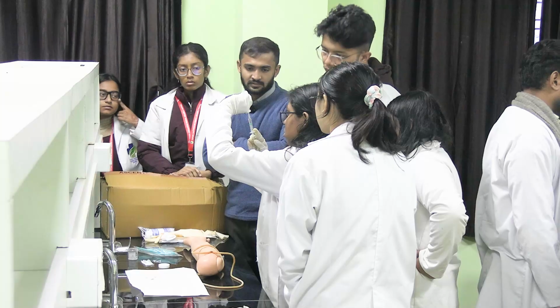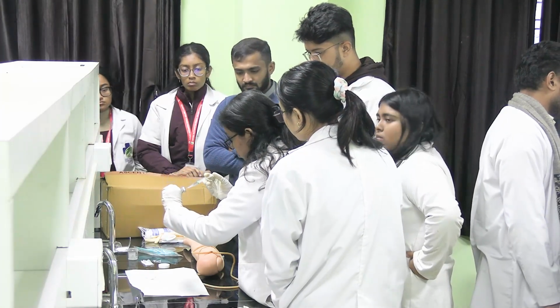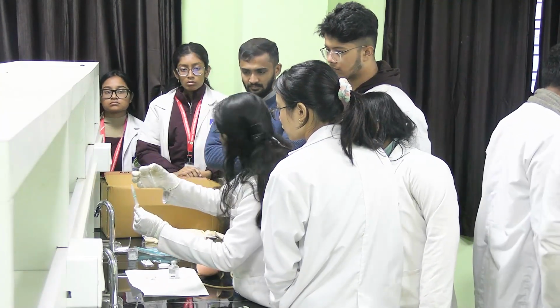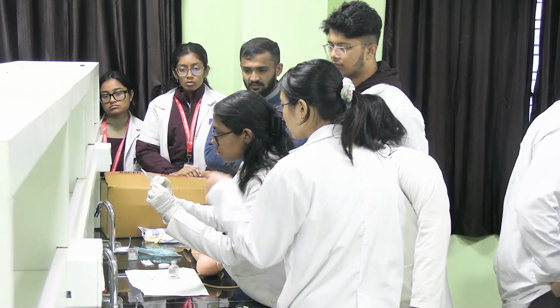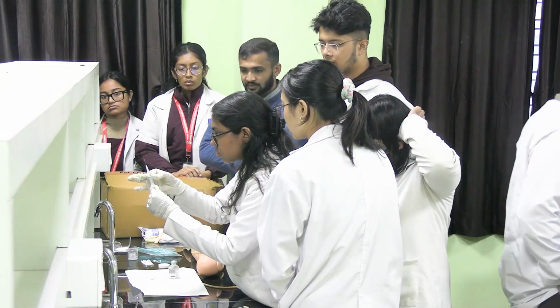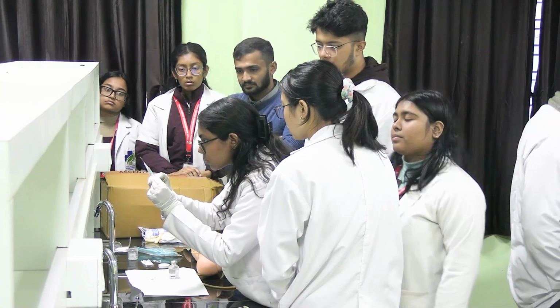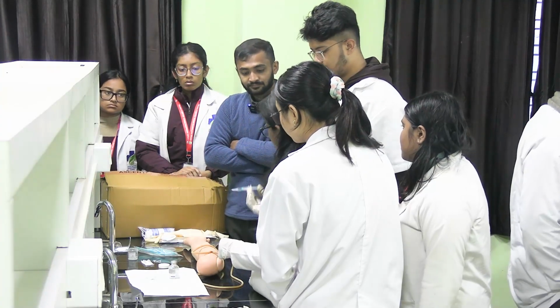If you're taking 1 ml, then 1.1. Remove it. Now you have to free the air bubbles. Don't touch the needle. Tap on the barrel. Without tapping, these bubbles and air won't be released. Tap it. Now check whether the mark is fine. 1 ml you have taken.